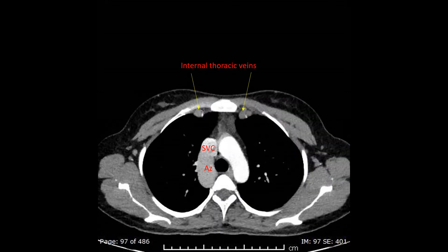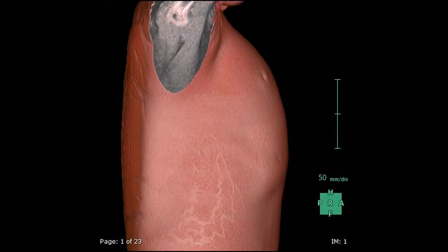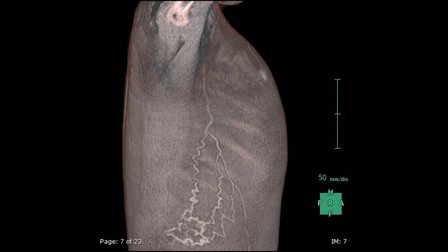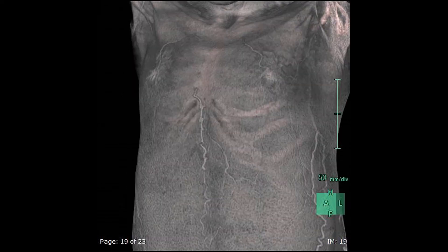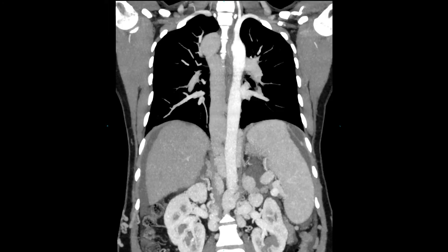We also see collaterals within the spinal canal and the hemiazygous system. This is how the collaterals look on the skin surface on the volume rendered images of the CT of the chest. Making the skin more transparent, we appreciate the collaterals better. And this is how the collaterals look inside the body — heavy collaterals in the upper abdomen and the markedly dilated azygous vein leading to the superior vena cava.